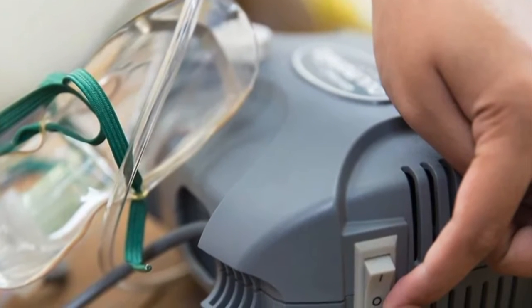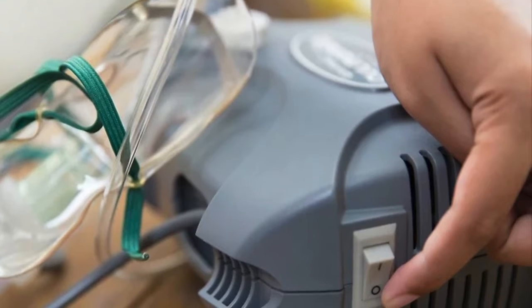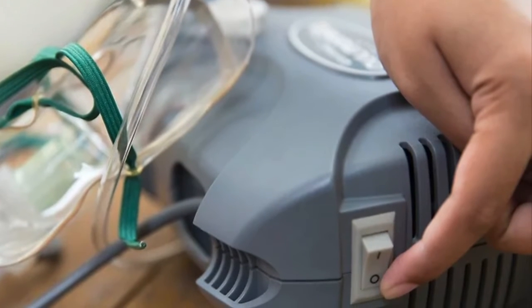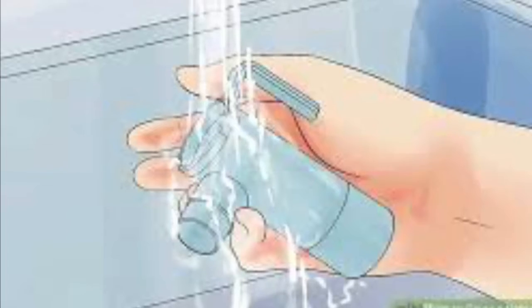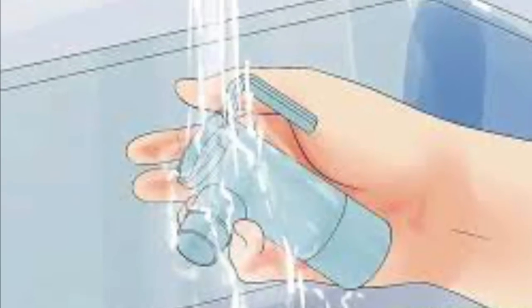Third step is to turn off the nebulizer and clean up. Be sure to unplug it from the outlet and detach the medicine cup and mouthpiece from the tubing. Wash the medicine cup and mouthpiece with warm soapy water and rinse them with water.